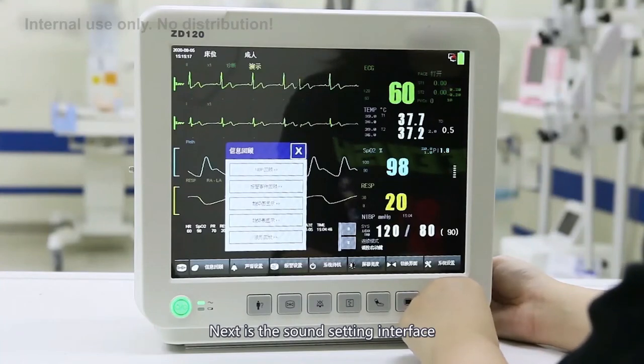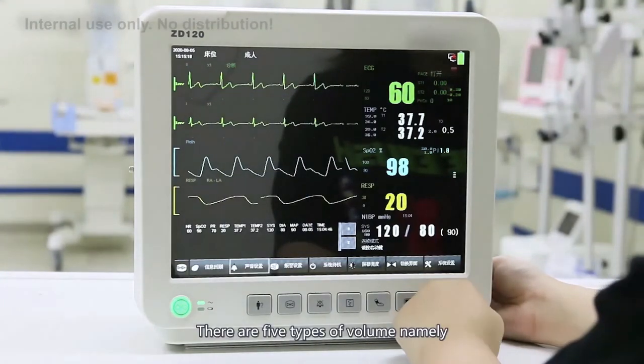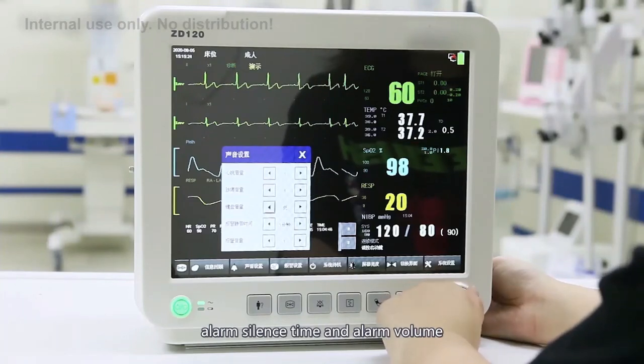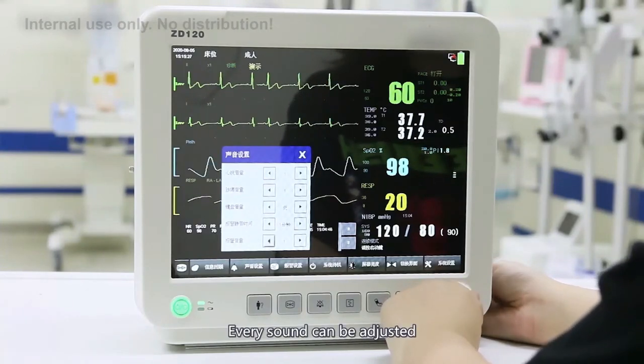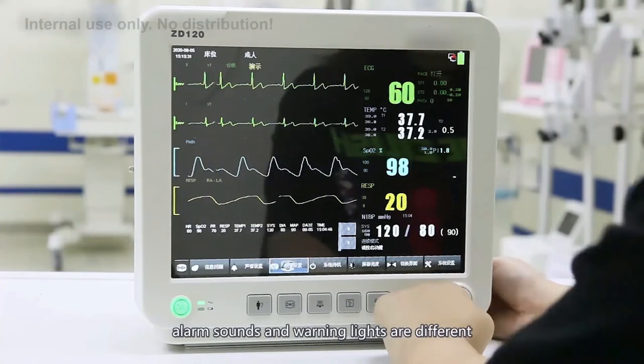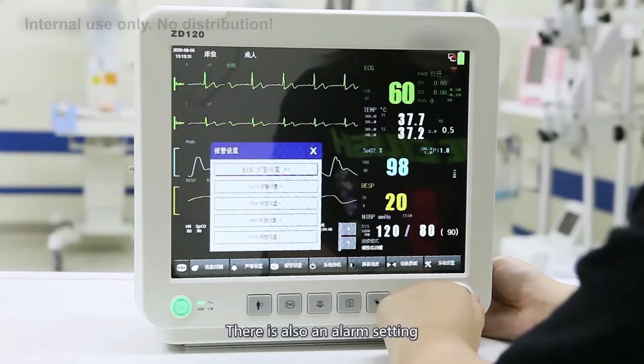Next is the sound setting interface. There are five types of volume settings: heartbeat sound, pulse sound, keyboard sound, alarm silence time, and alarm volume. Every sound can be adjusted. Different alarm levels have different alarm sounds and warning tones. There is also an alarm setting section.